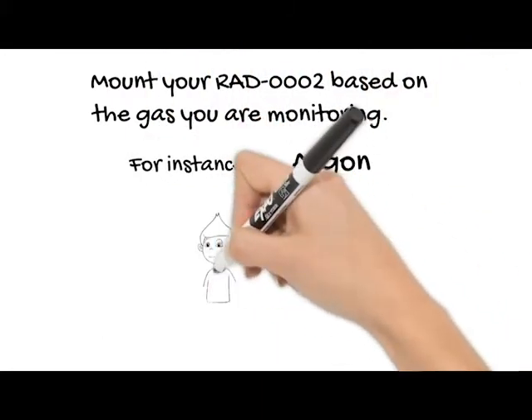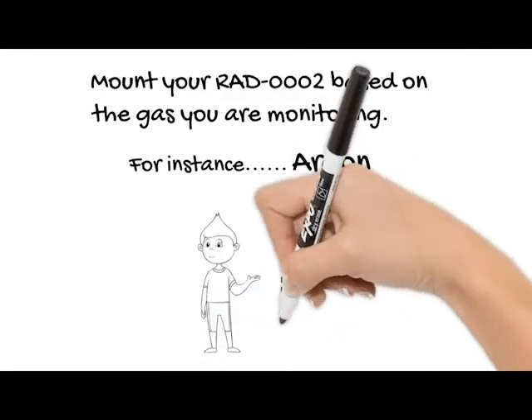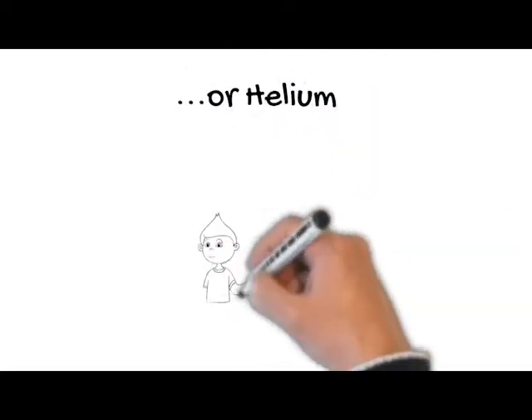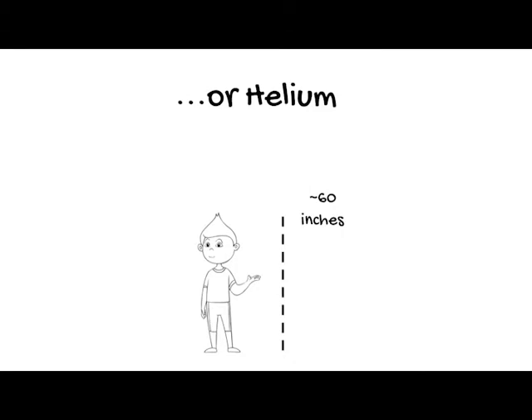The oxygen sensor should be mounted at a height that corresponds with the associated gas. For example, if you were storing argon, you would want to mount the sensor approximately 24 to 30 inches from the floor. If you were storing helium, you would want to mount the sensor approximately 60 inches from the floor.